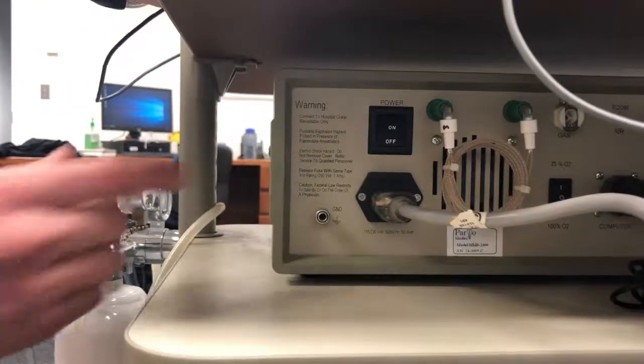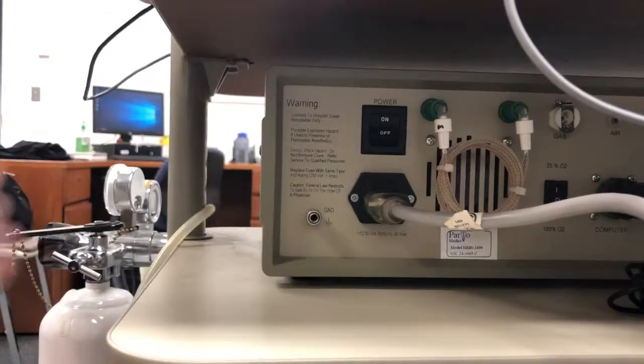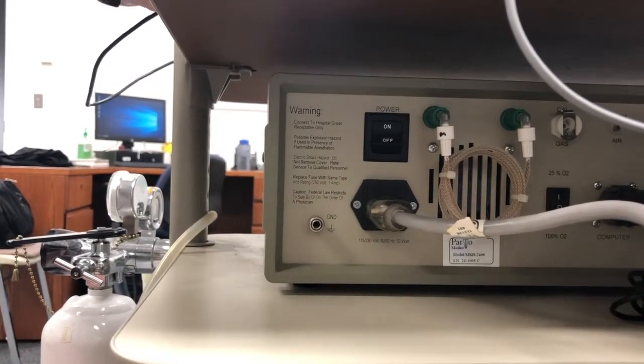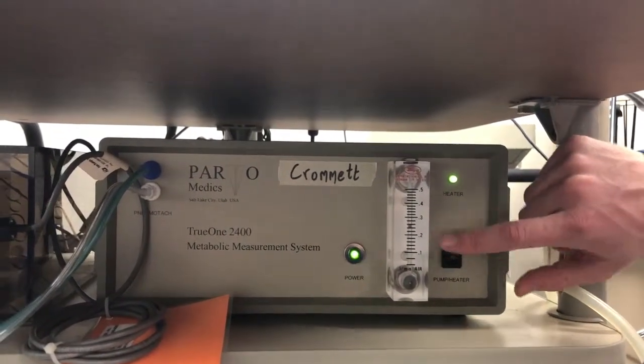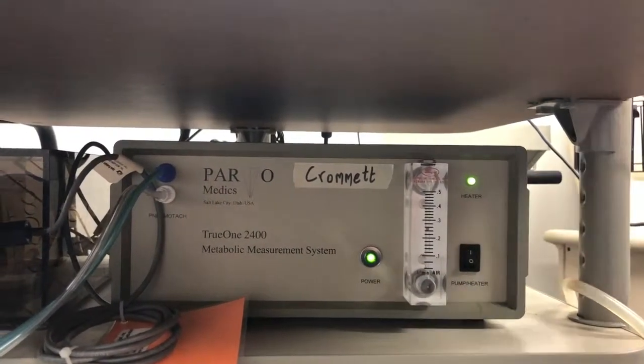The first power button you're going to turn on is right on the back of the machine. The second button you're going to turn on is the pump here. You should see this dial go up and this light come up.